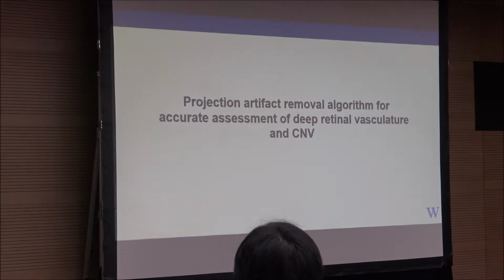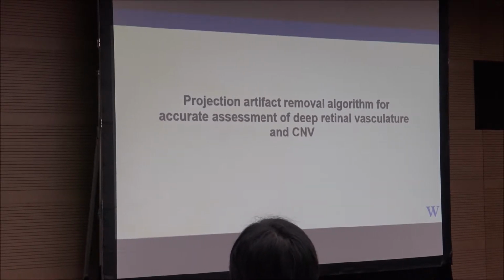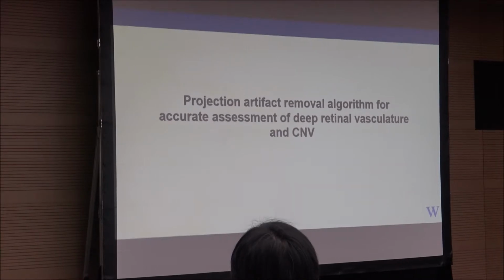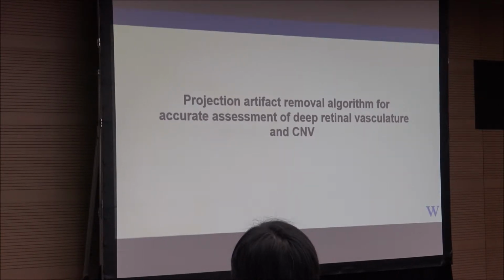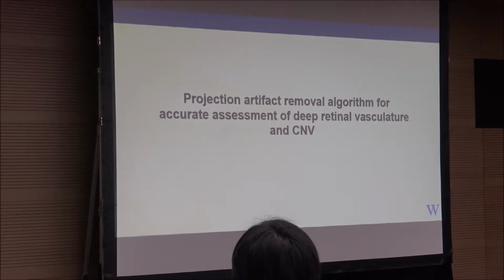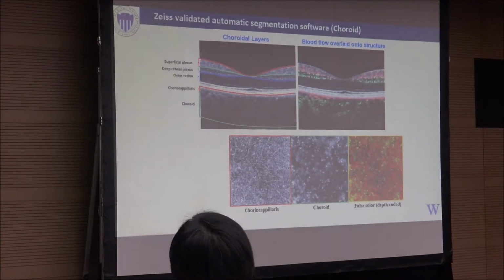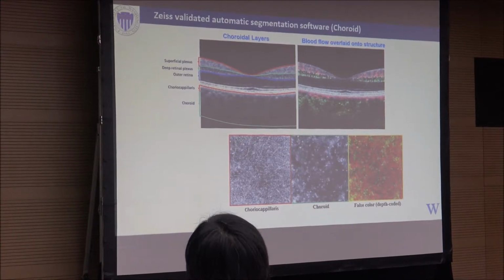We are using a method that is a little bit different from Professor Jia, because Professor Jia is looking at 3D projection artifacts removal, while our approach is using 2D projection artifacts removal, which has more clinical utility, because right now clinicians are used to 2D projections. I will walk you through an example of the CNV quantification with the projection artifact removal.